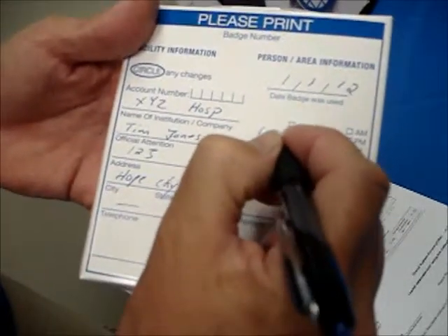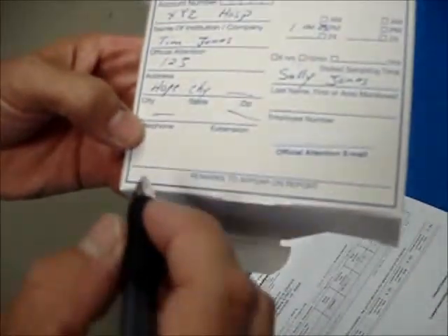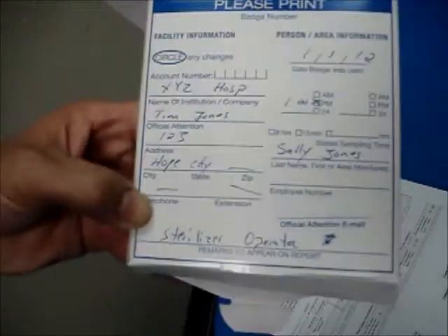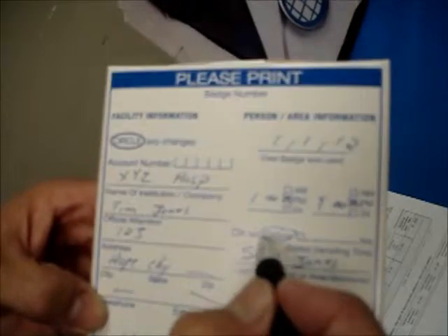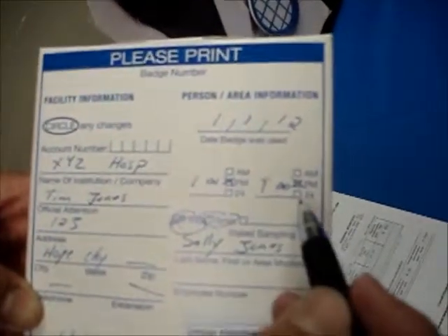Let's say it's 1 o'clock PM when we start. The person's name using the badge is Sally Jones. And what was Sally doing? She is the sterilizer operator today. We're going to fill in the stop time at the end of the shift. So if Sally wore the badge until 9 o'clock PM, then we add that there. If it's just a 15-minute badge, you can just cross that. If it's a known eight hours, then you can cross that. But if you're not sure of the exact time, you can put the start time and the stop time. Very critical.